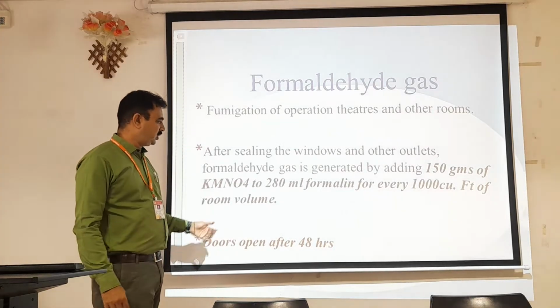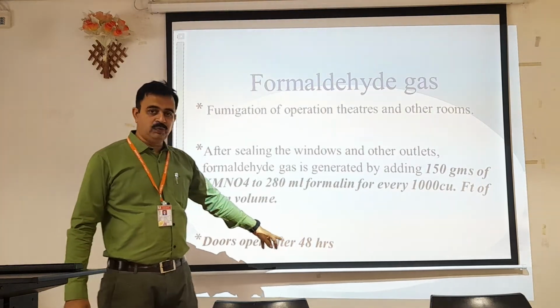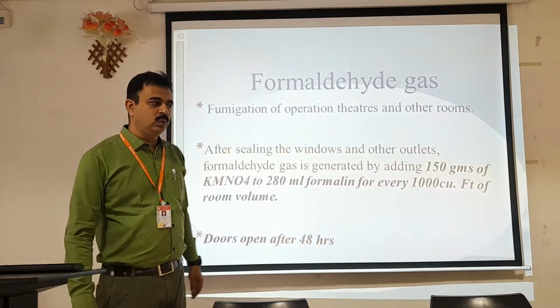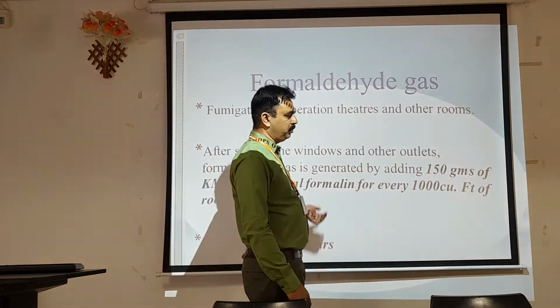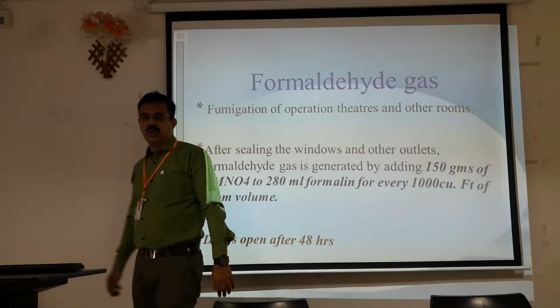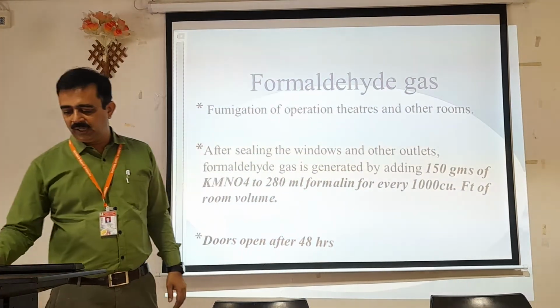So this is the way by which it can be done. Doors are opened after 48 hours. They have mentioned 48 hours here, meaning for 2 days you can keep this mixture inside the room, by which the room gets sterilized with the help of gas, that is formaldehyde.